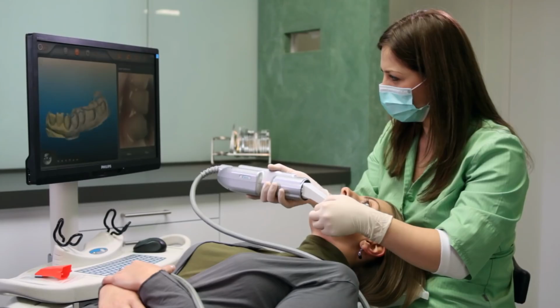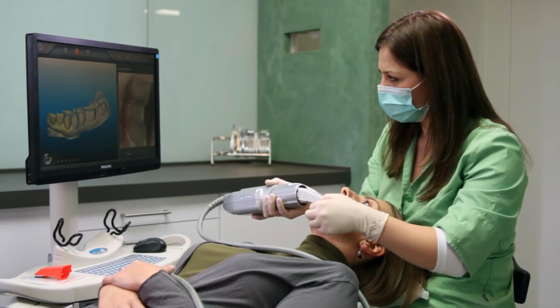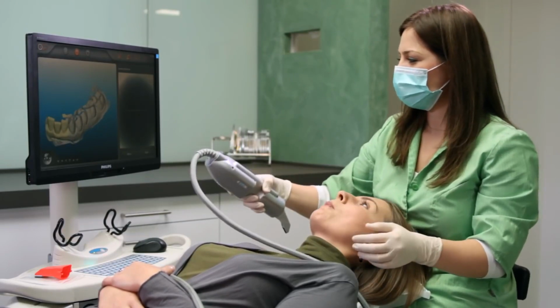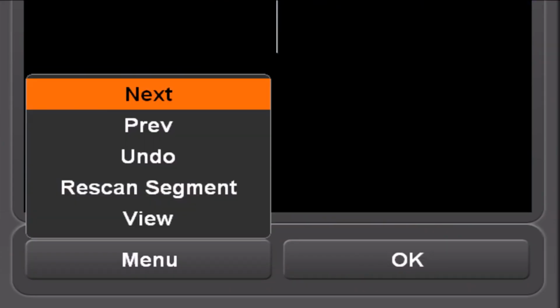As you approach the anterior, the scanner is going to turn with the shape of the arch in order to scan just beyond the midline. Continue by pressing the pink foot pedal, followed by pressing green to say next segment.